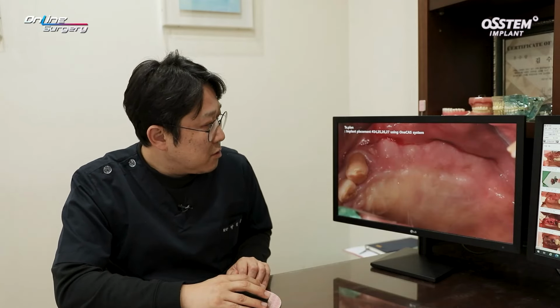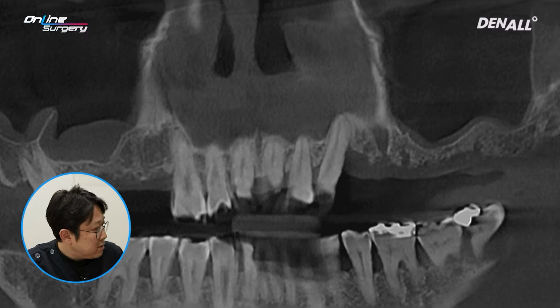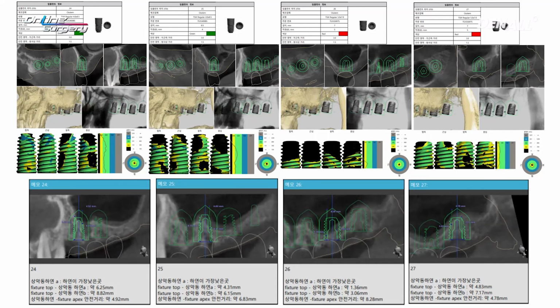If you look at the intraoral image, the bone width looks sufficient. I don't think it's going to be a problem in doing flapless surgery. If you look at CT, the sinus floor does not look fairly even. There is a little bit less residual bone here, but this is not going to be a problem in doing crestal approach. Guide was included in the treatment plan.